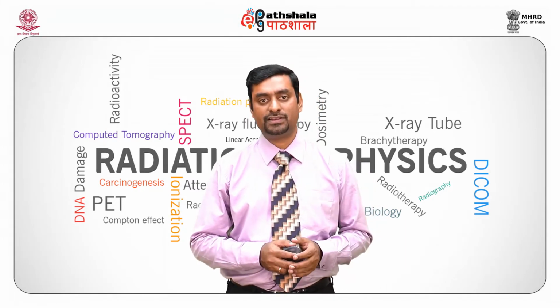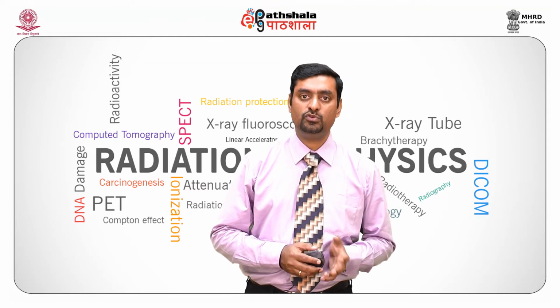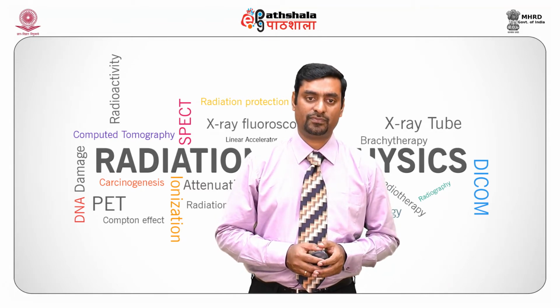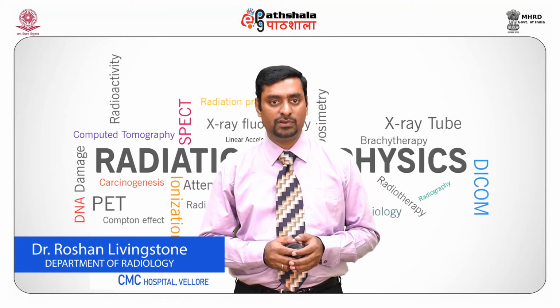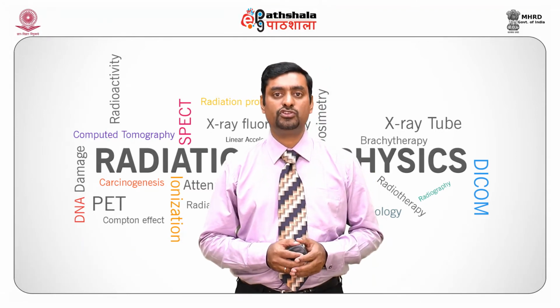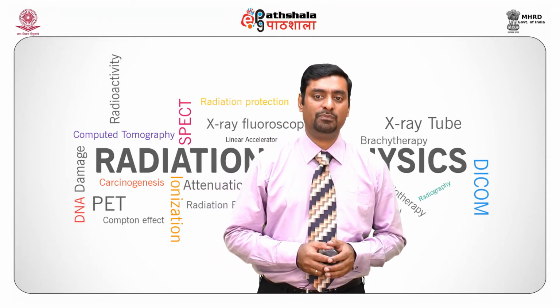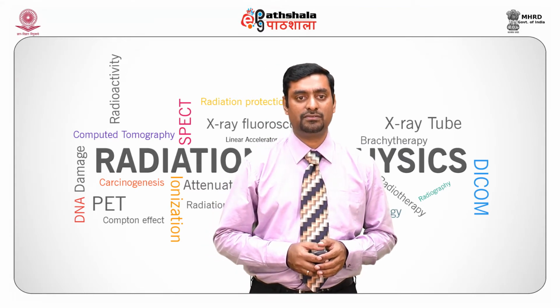In these machines, tungsten or tungsten rhenium anode can be used to withstand high heating. A choice of 3 filters such as molybdenum, rhodium or aluminum is present in the Slotscan scanner. Typically, higher tube voltages of 31 kVp are used by these tubes compared to the molybdenum or rhodium target.